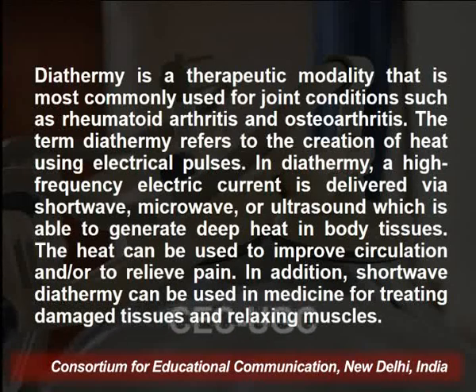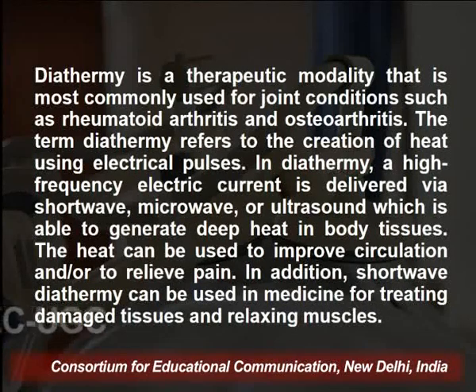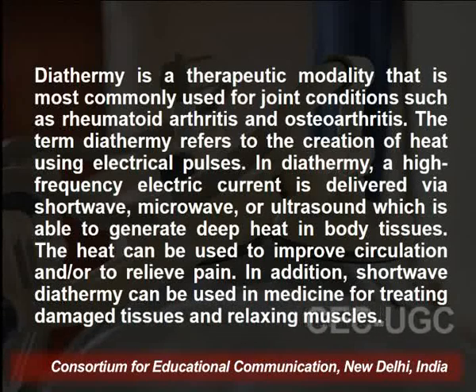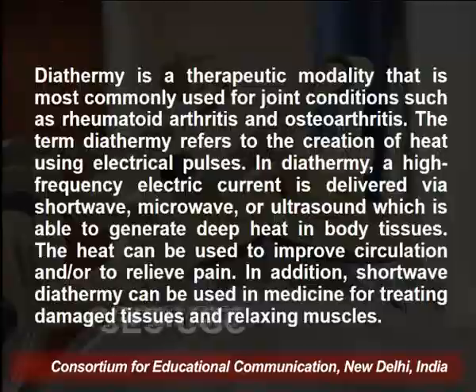In diathermy, a high frequency electric current is delivered by short wave, microwave and ultrasound, which is able to generate deep heat in body tissues. The heat can be used to improve circulation and to relieve pain. In addition, shortwave diathermy can be used in medicine for treating damaged tissues and relaxing muscles.